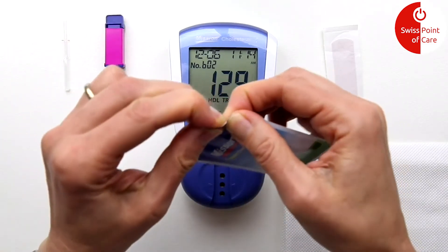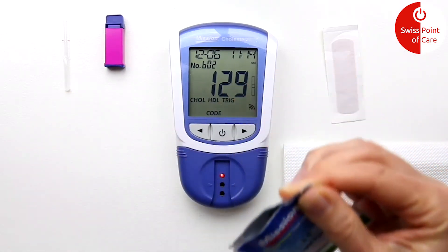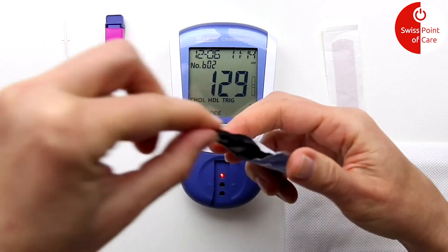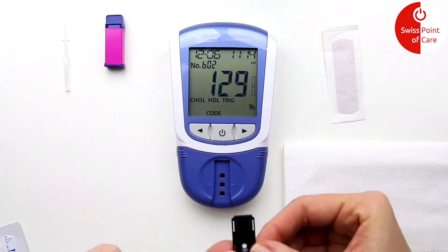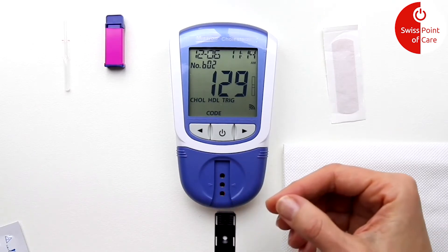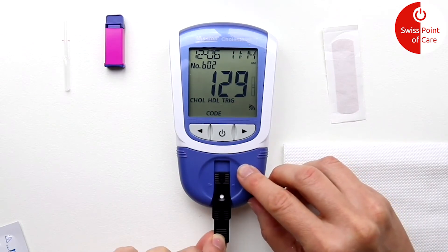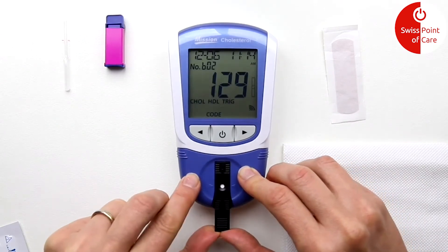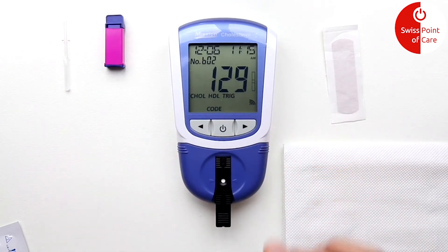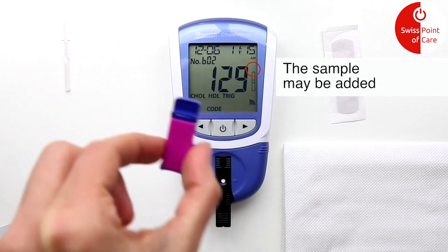You can now insert the test strip in the direction of the arrow. Make sure that the test strip is inserted completely. Check on the display whether the blood drop symbol flashes at the top right.